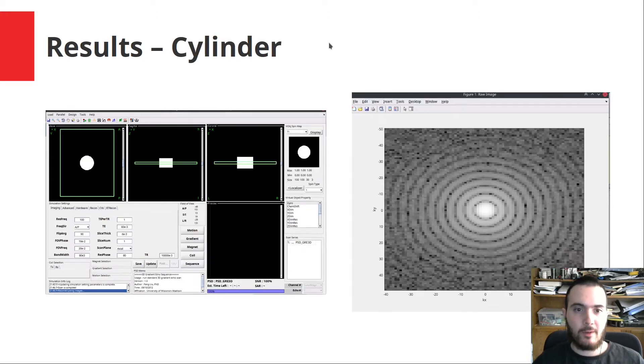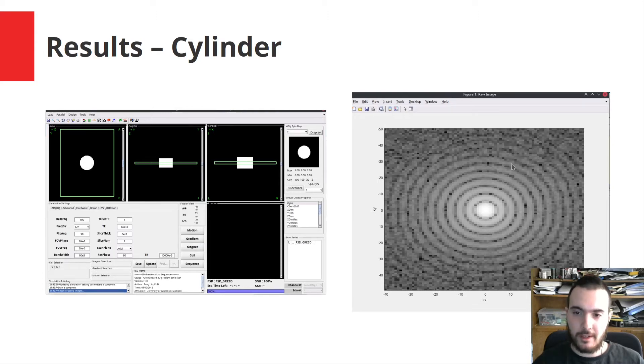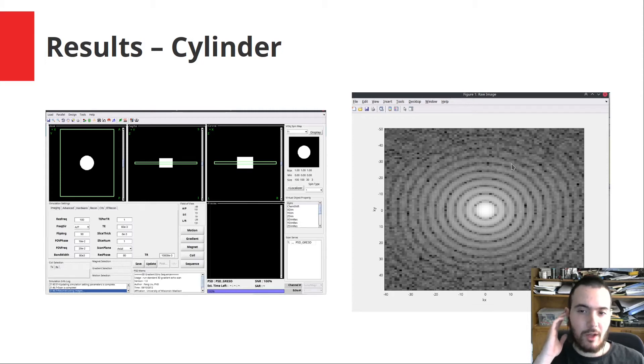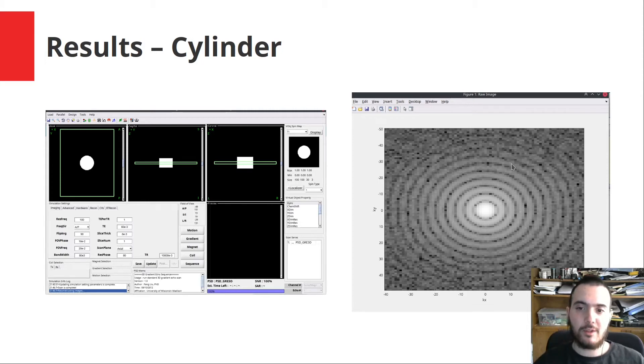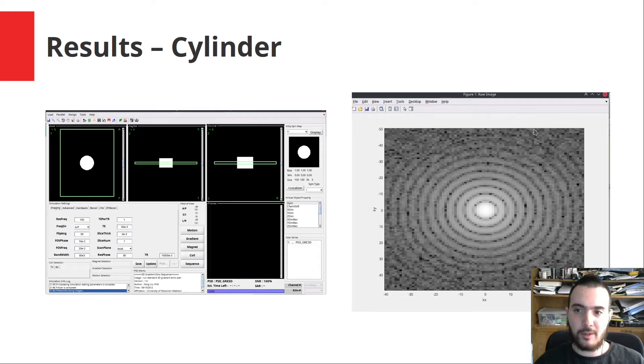When we take a cylindrical object whose cross section is a circle, we see that the resulting raw image is a Jinc function, which is a J1 Bessel function over X. It is similar to the Sinc function but it is different. You can see from the image that we do have it with actually a bit of noise coming from the imaging technique as well.